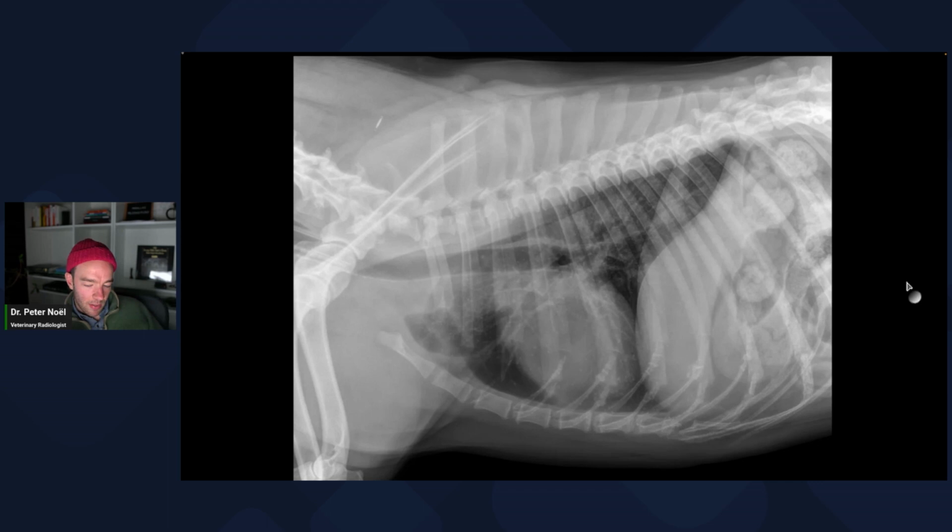So heterotopic bone, osseous metaplasia, we don't care about it. These are not osteosarcoma mets. These are a no-touch or a gee-whiz kind of finding, and should not be confused with pulmonary metastasis.